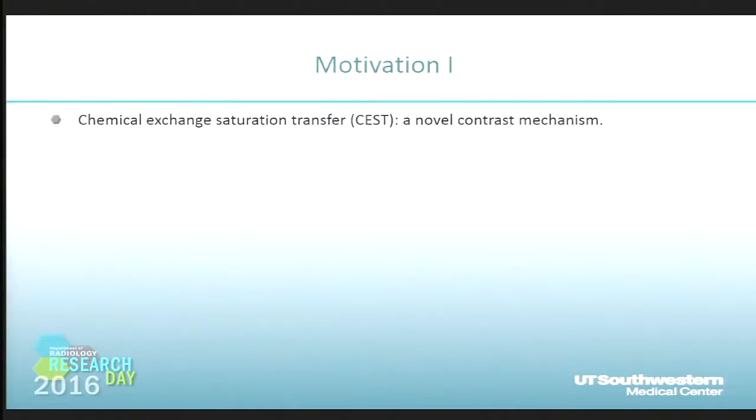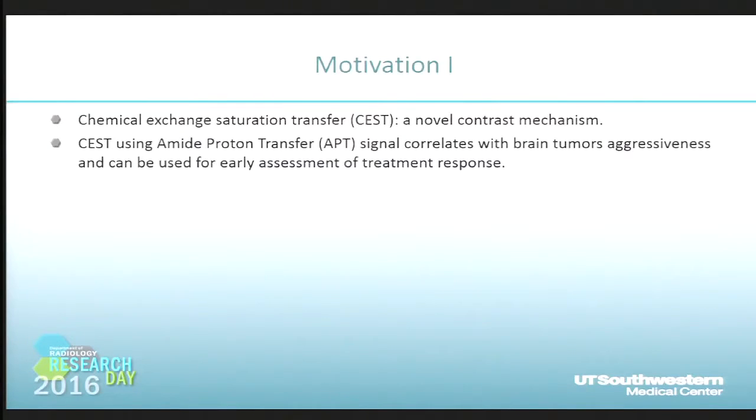Thank you for your introduction, and good afternoon, everyone. Chemical exchange saturation transfer, or CEST, is a novel contrast mechanism for proton MRI. It can reflect biochemical compositions of tissues. Emergent studies suggest that CEST signal in the amide group range, or the APT signal, correlates with brain tumor aggressiveness and can be used for early assessment of treatment response.